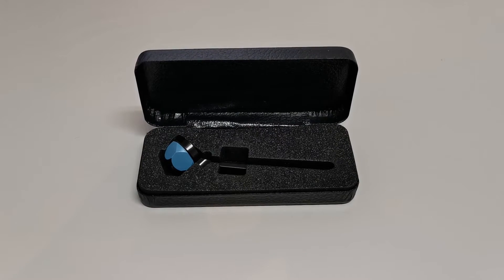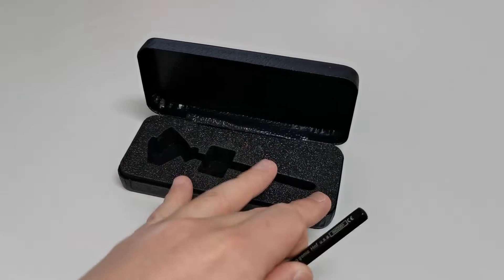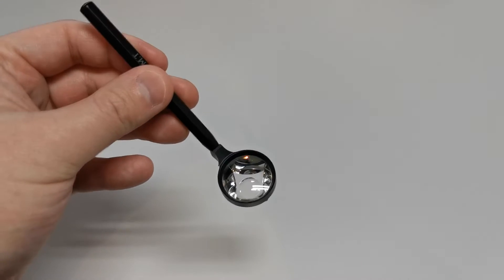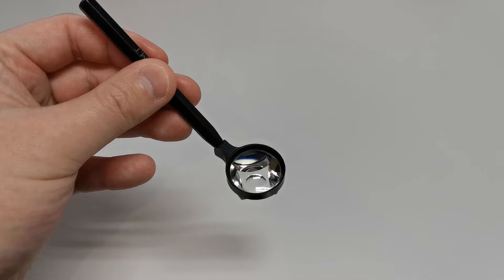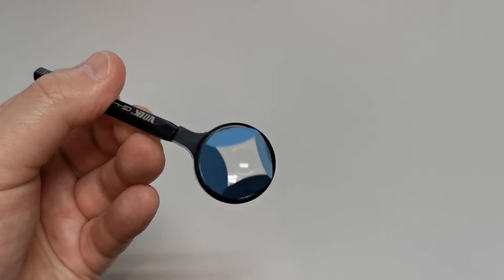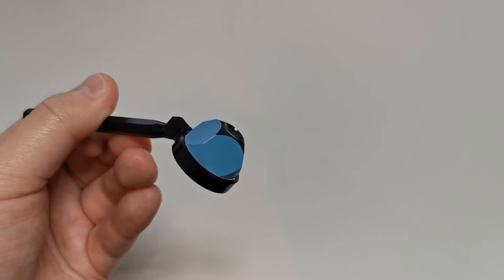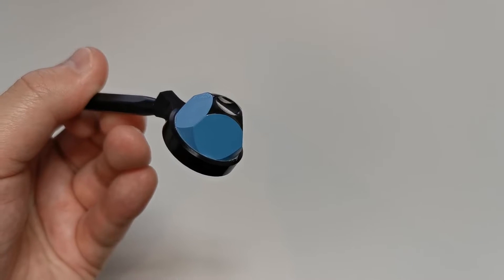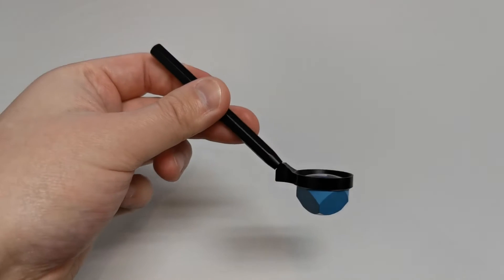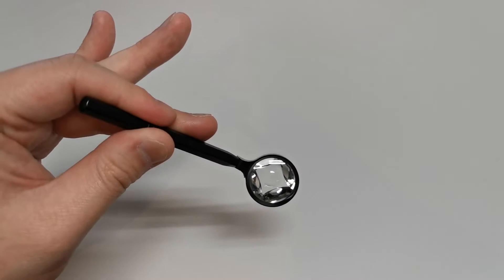This here is my own gonioscopy lens that I use in practice. There are a few key features that drew me into purchasing this lens in university. Firstly, it is a four-mirror lens, and that allows me to assess the angle by simply moving my slit lamp around. Second, it doesn't have a flange, and that allows me to perform indentation gonioscopy. Thirdly, it has this handle, and I particularly like the distance my resting hand is from the slit lamp forward rest to the patient's eye.